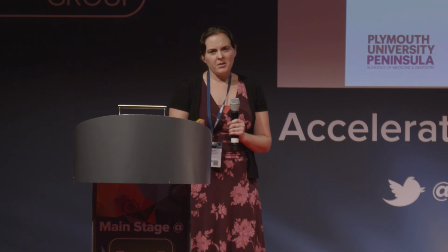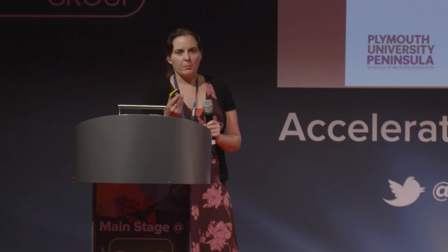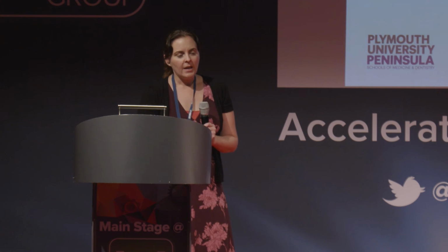And what you can do with the haptic machines, if you haven't come across Haptics before, it's basically like virtual reality with feedback. It started in the aerospace industry, I think, and you basically have a virtual reality tooth and a real handpiece. And when you drill the virtual reality tooth, you actually get feedback on the handpiece as if you're drilling a real tooth. So it's a way for students to practice again and again, but without using up the resource of the plastic teeth. However, there are some things that can't be done on the haptic machines, and that's where the phantom heads come in.